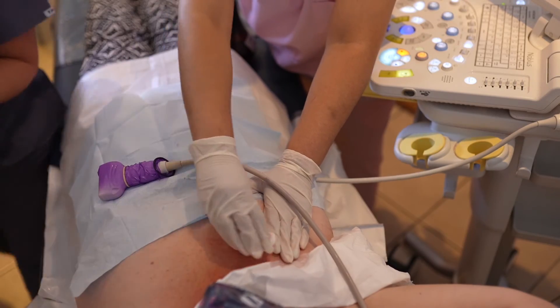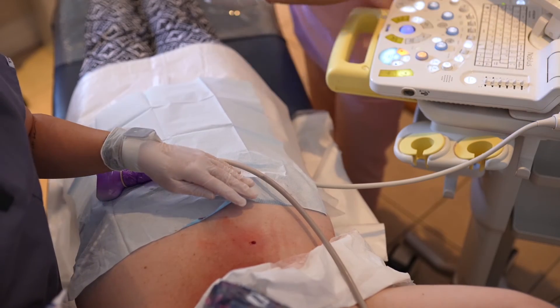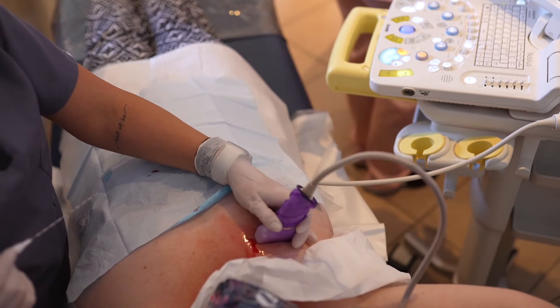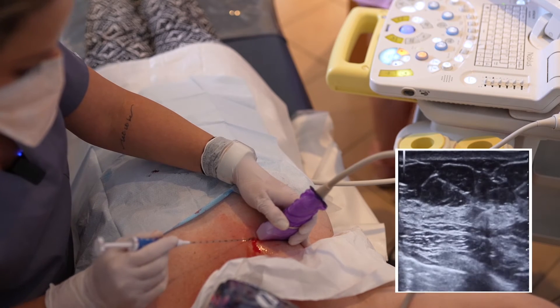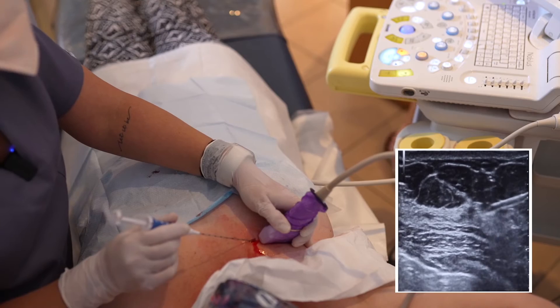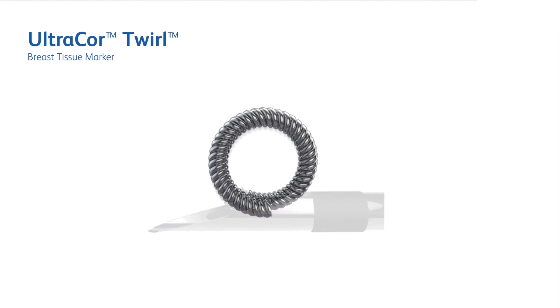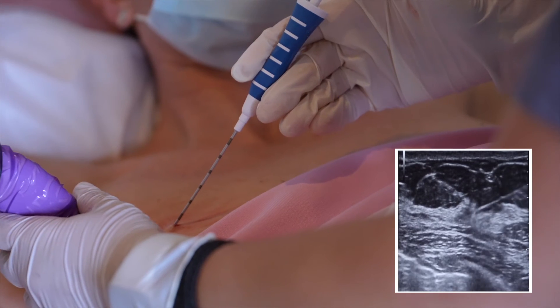The lesion or area of biopsy is then located and the needle inserted. If using the marquee kit, it is recommended to leave the coaxial in place and proceed with the twirl through the coaxial to minimize trauma and place it in the correct position. Once in position, fully depress the device to deploy the marker from the needle tip. You will see it deploy into a round shape, which hooks into the tissue and minimizes migration, allowing for accurate placement.